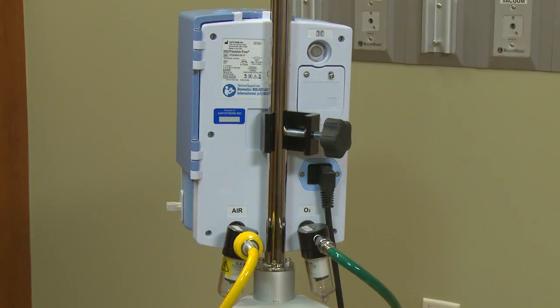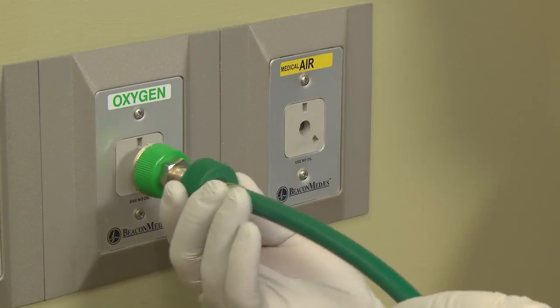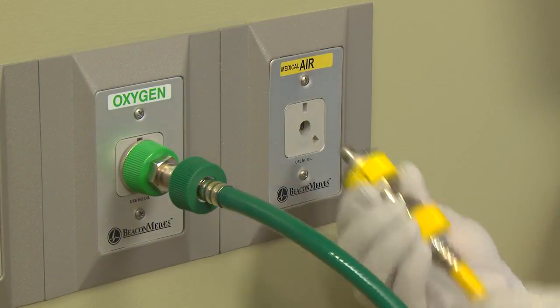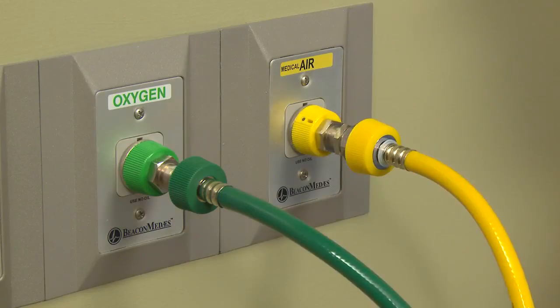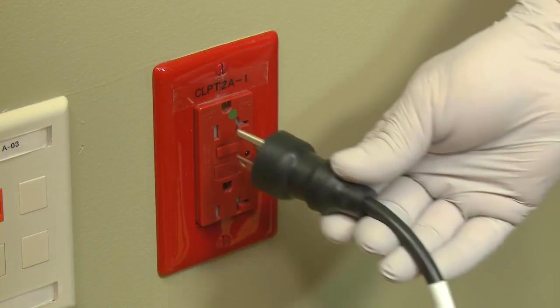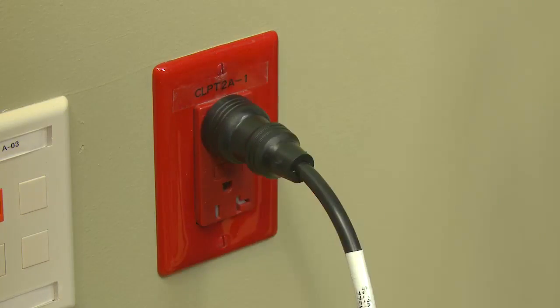To connect the O2 sensor, first connect the air and oxygen to an approved source using Quick Connects. When connecting the air and oxygen hoses to the gas source, make sure that both inlet filter traps are pointing downward. Next, plug the power cord into a facility-approved outlet.